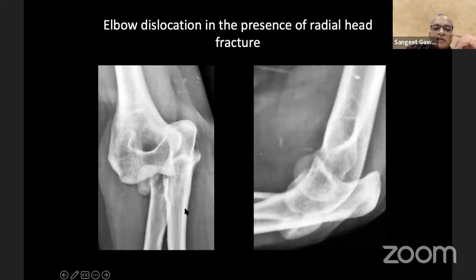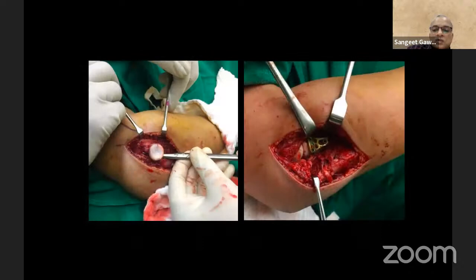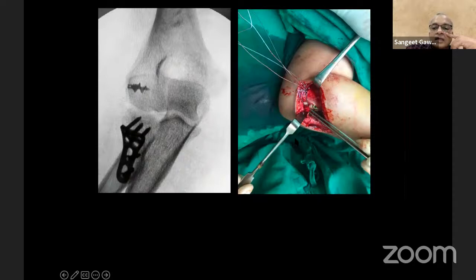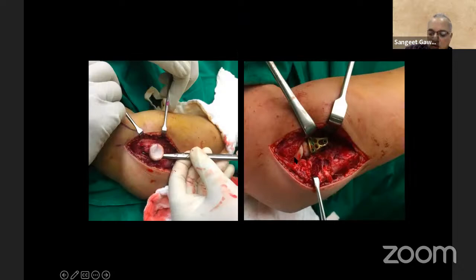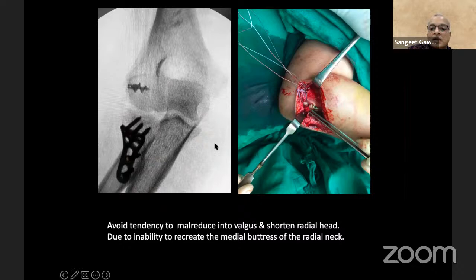Here the coronoid is intact, so it's not a terrible triad injury. Okay. So simple radial neck fracture, but it is associated with elbow dislocation. So what we need in this is to refix this fragment of the radial neck, head neck. And then, why is there a dislocation? There is a disruption of the lateral ulnar collateral ligament. So this is how it is repaired. The radial head is fixed. The radial head is fixed with a plate.